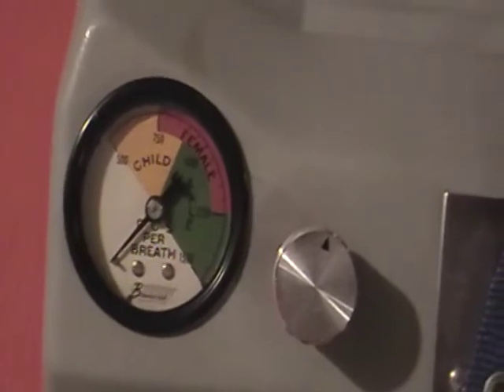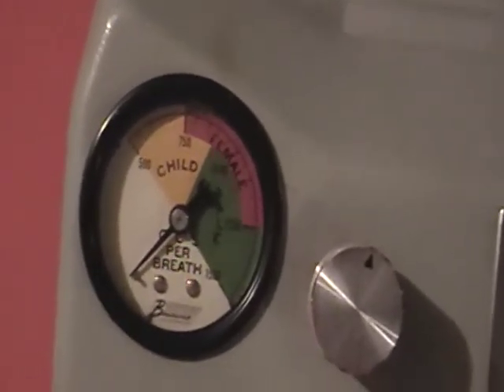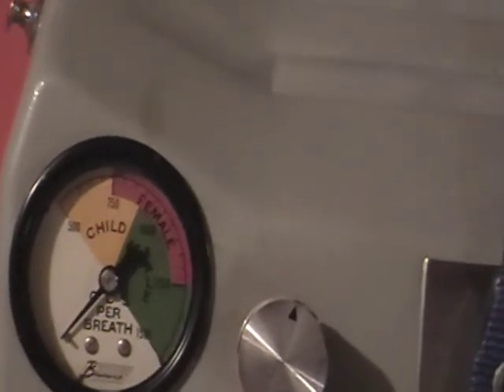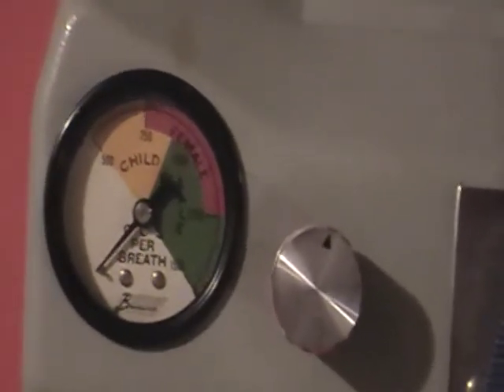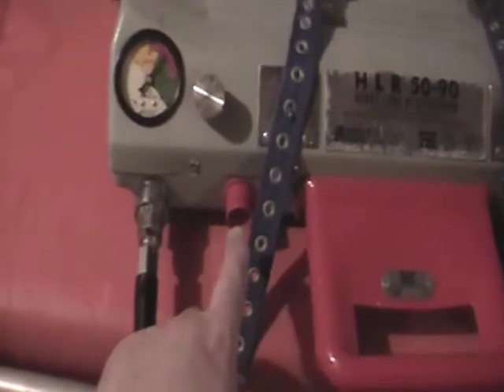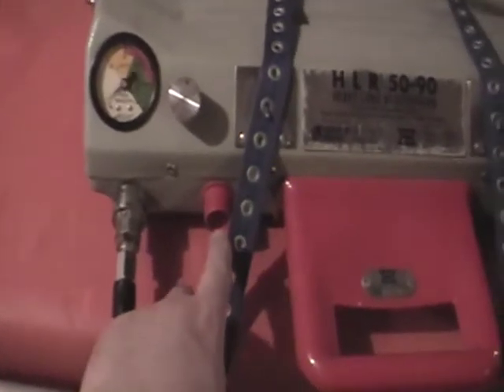The artificial respiration is calculated in cc's of air per minute and is divided for child, female, and male. When we turn the machine on, it does a five-to-one ratio — five compressions for one breath — and the air comes out of the hole right here.